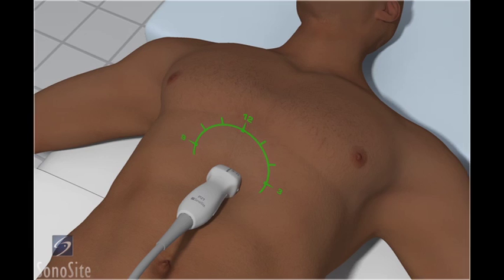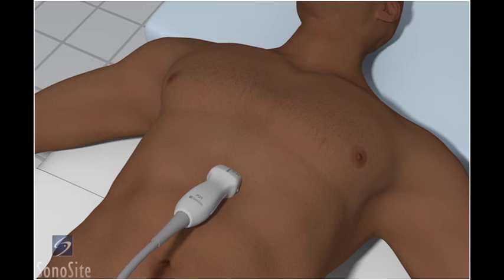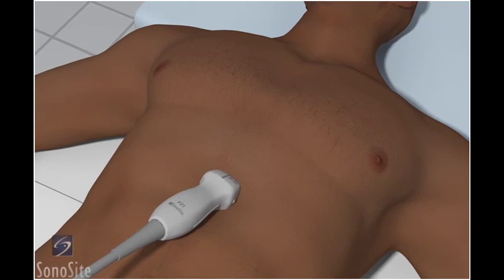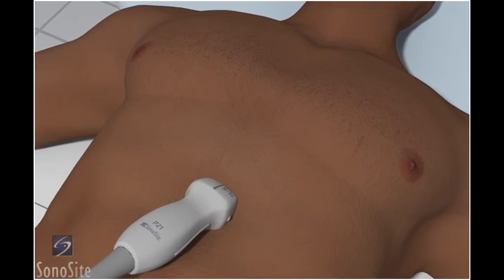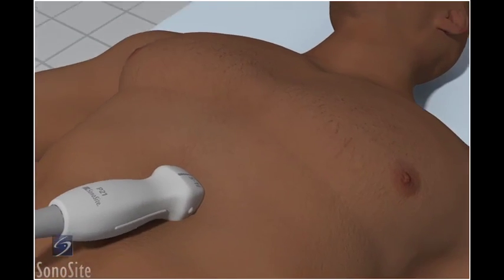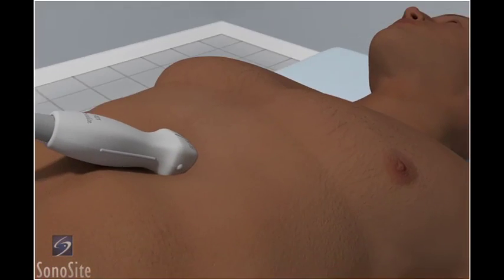This view uses the liver as an acoustic window to visualize the four chambers of the heart. Aim the transducer slightly toward the left shoulder with approximately a 15-degree angle to the chest wall.